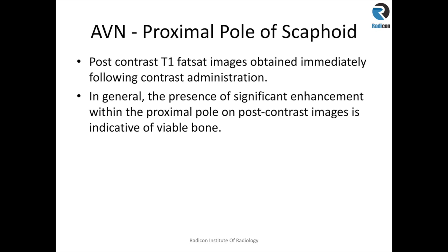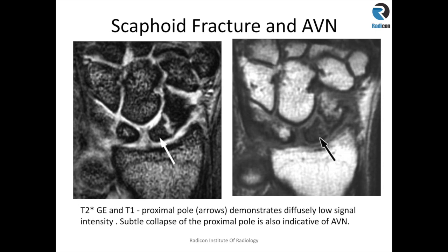To further assess viability, you can do post-contrast T1 weighted fat-sat sequences to see if there is enhancement in the proximal pole, which would indicate blood supply and confirm the proximal pole is still viable, guiding surgical planning. This case demonstrates likely AVN on the basis of MR findings. On T2-star gradient echo, there is low signal intensity in the proximal pole, and diffuse low signal intensity on T1 weighted images. Patchy fat signal is present within the distal pole and other carpal bones, but the proximal pole is diffusely low T1, meaning almost all the fat is gone and this is unlikely to be a viable proximal pole.